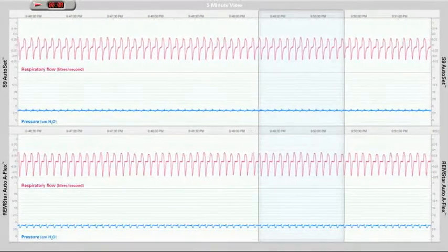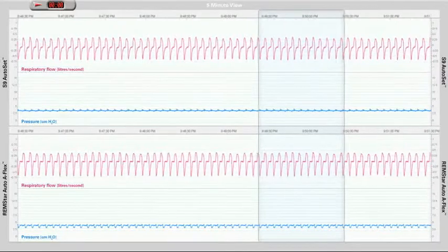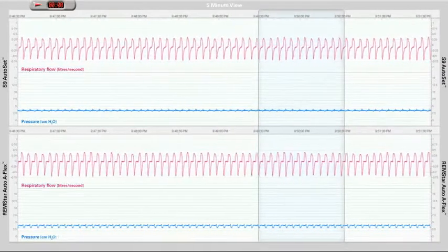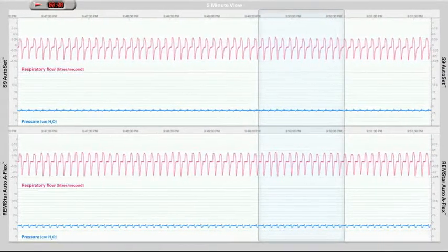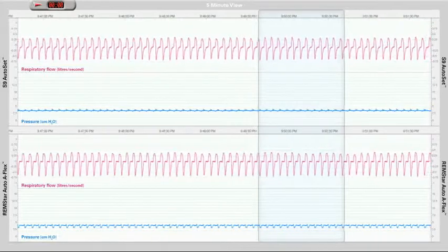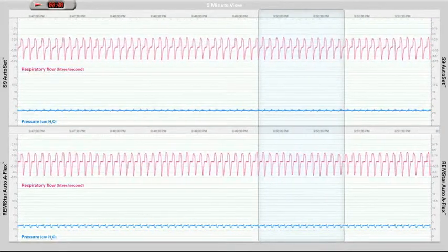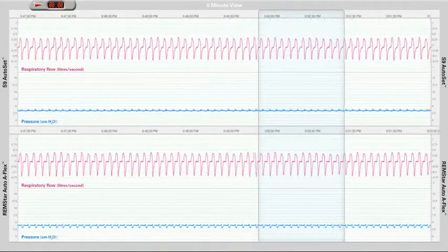In this presentation, two different APAP devices are connected to a breathing simulator and tested for their responses to a simulation of the same typical OSA patient.